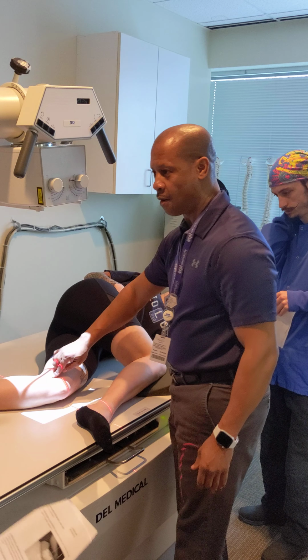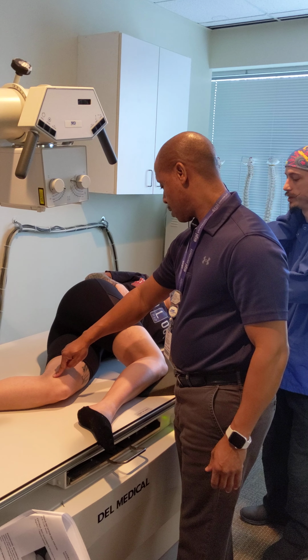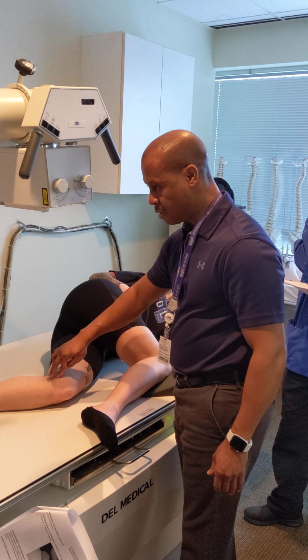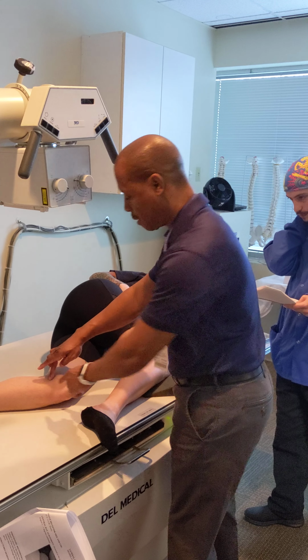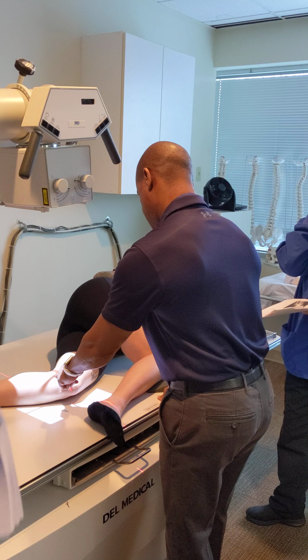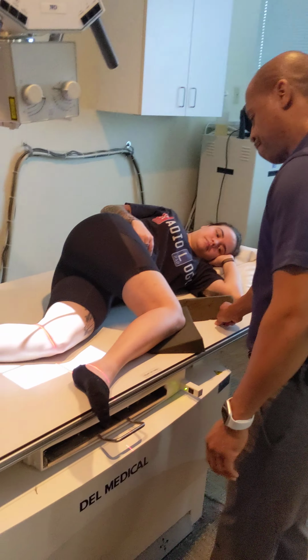1 inch distal. Now, what does the word distal mean? Away from the attachment. Farthest away. All right, so 1 inch. So right there, just going distal kind of means just down. About right there is where I need to be. Boom. That's all we're doing.